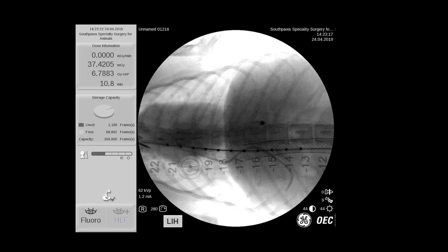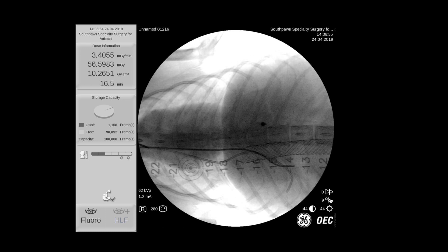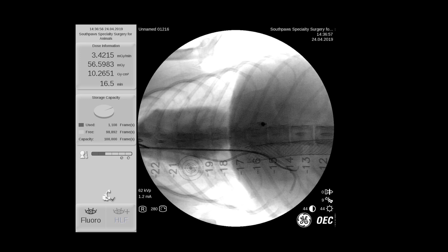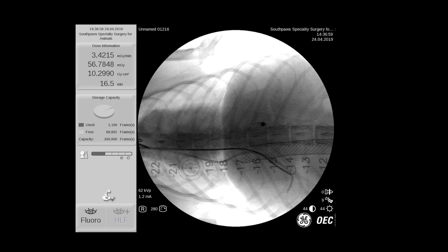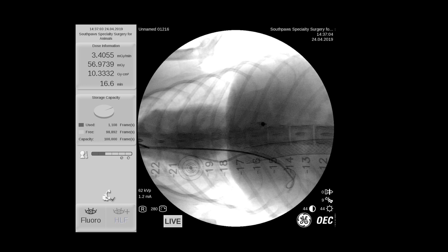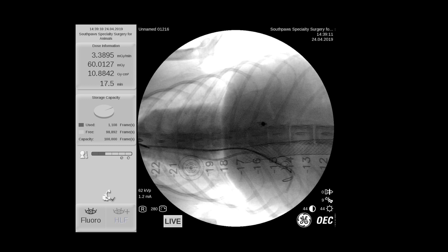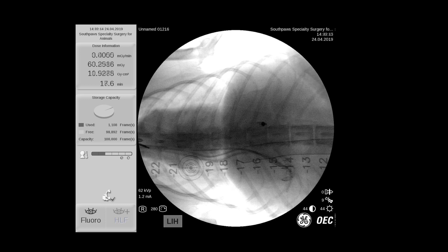At this point we've placed a catheter inside the portosystemic shunt and we're simultaneously measuring pressures within the portosystemic shunt and within the vena cava. Now here we're starting to place coils through the stent and into the portosystemic shunt, and these will gradually occlude the intrahepatic shunt until we get a gradient in blood pressure between the portosystemic shunt and the vena cava.